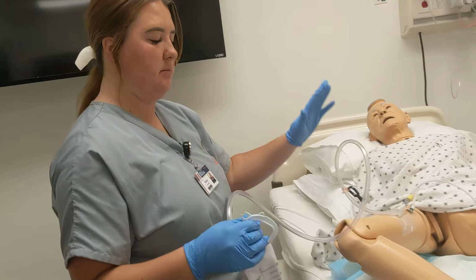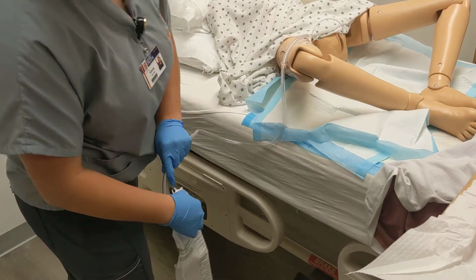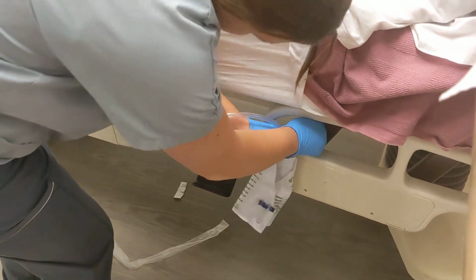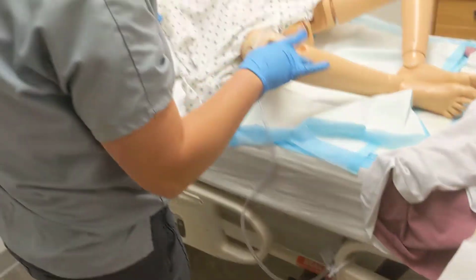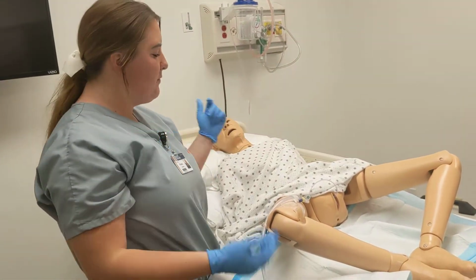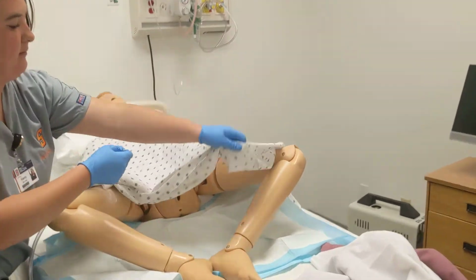And then we will just want to hang it down here on the bed. We just want to make sure that it is below the thigh. So we'll try to hang it right here. Let's see where we can hang this. We'll do right there. All right, and so now I would wipe off any iodine or lube that's gotten on the patient, because that can be irritating. So we'll wipe that off.